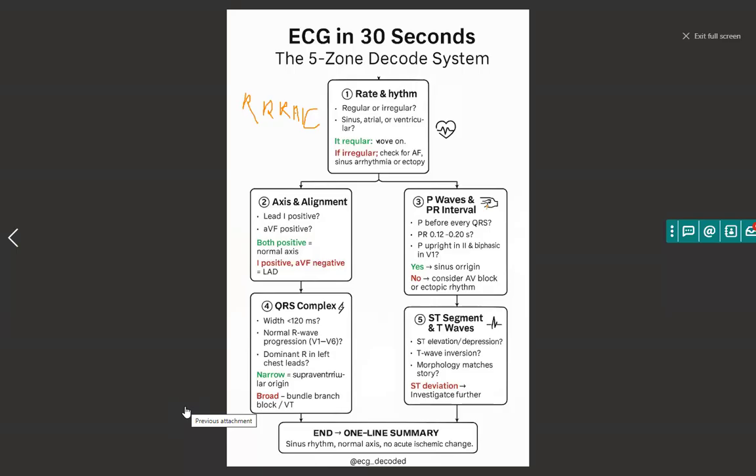And you just want to get that out of the way. But I will explain. It may mean something and it may mean nothing, but I will get to why it can mean something and why it can mean nothing when I get to the C part of the RAIC. And basically, just so you know, the axis does have deeper meanings. For example, a normal axis is between minus 30 to 90 degrees. Well, you can memorize that for exams.